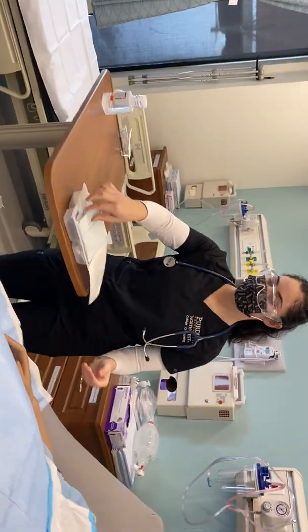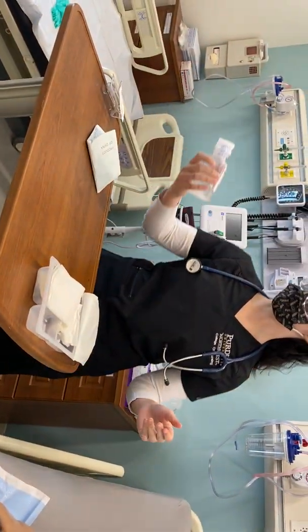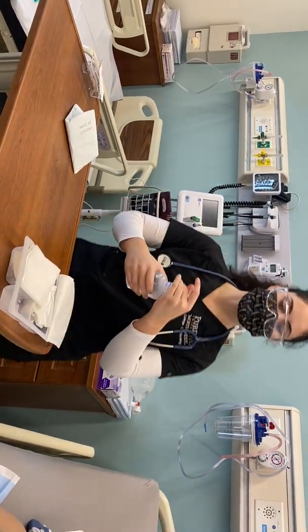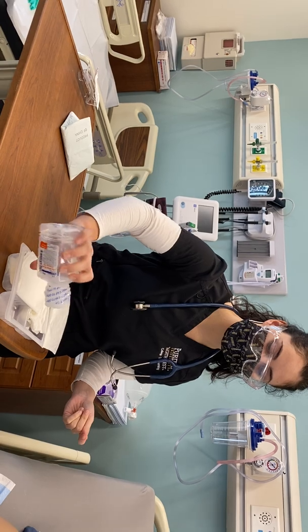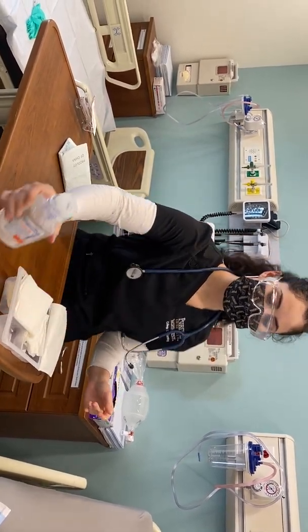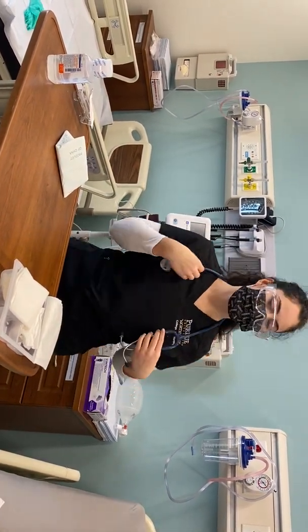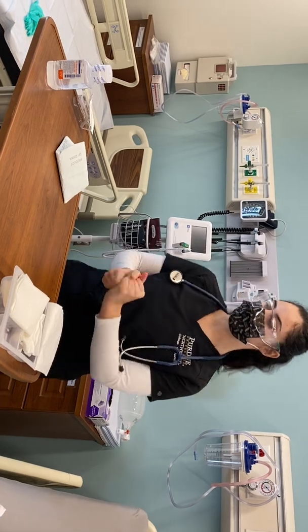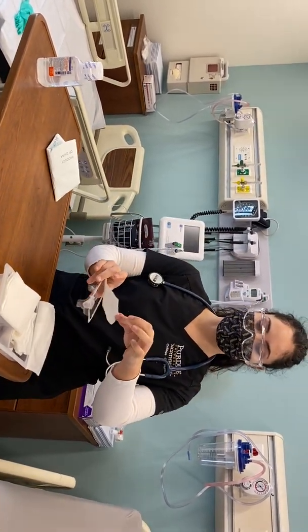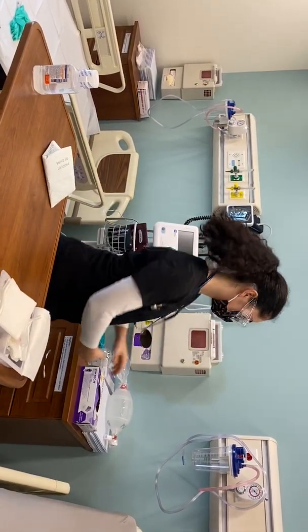I'm going to take out my sterile gloves. I'm also going to take my saline, the same one I already checked the expiration on. I'm going to label it because I know I just used it. Open the cap, pour some. You know what, I'm going to go around, pour some in here. Then hand hygiene. Now I'm also going to take the new inner cannula and dump it in. Throw this out. Hand hygiene.